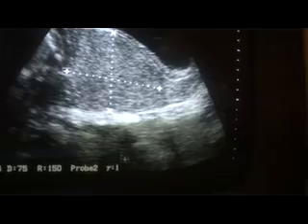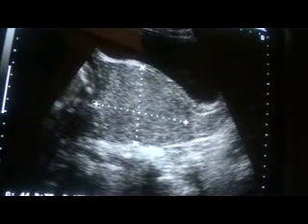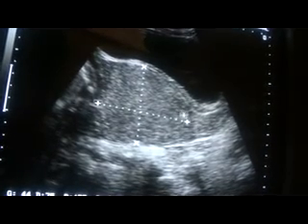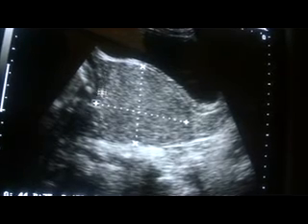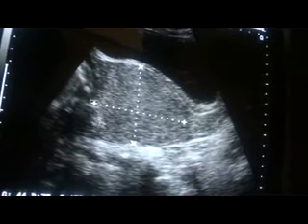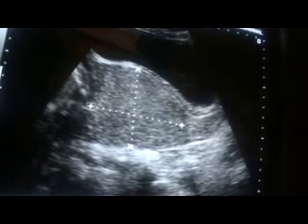It measures 9.2 centimeters into 6.7 centimeters and is evenly echogenic, with no posterior wall acoustic enhancement. This shadow is that of a bowel and not from this echogenic mass. This is the bladder wall, and this is the urinary bladder in transverse section.